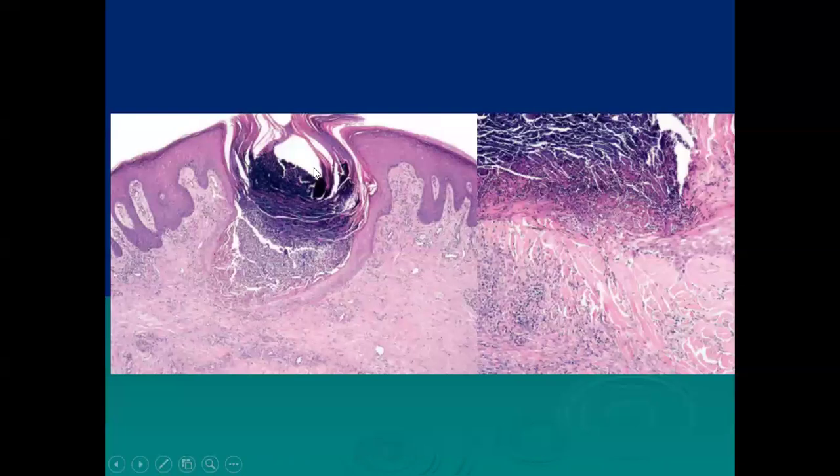There is a necrotic crust in the center of this papule, and on higher magnification, you can see the collagen bundles oriented vertically, showing that this collagen is being extruded out of these erosions. So this is reactive perforating collagenosis, a kind of perforating disorder.